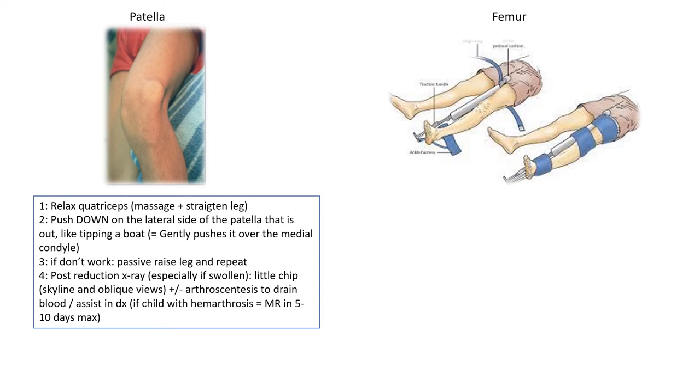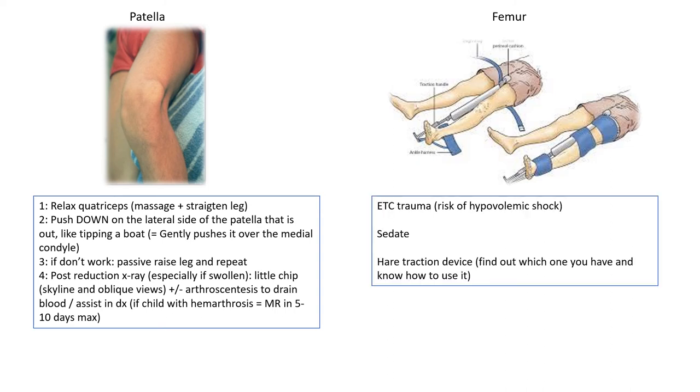Femur fractures, usually that's big trauma, and I won't go into too many details here, but in general, you have to use traction to put it into place. There's lots of these devices, and each device is different in all the places I've ever worked. Look it up at your own place. We usually use what you call a hare traction device, but there are lots of different smart and not so smart devices. So use the one that you have at your place and get comfortable with it.